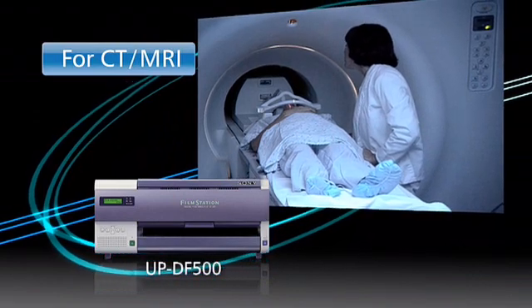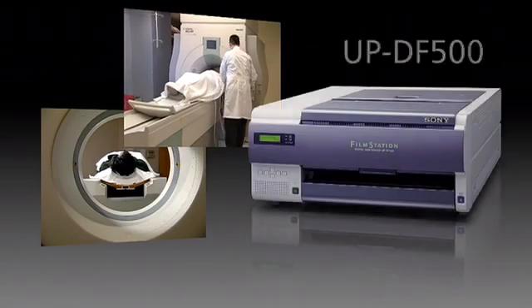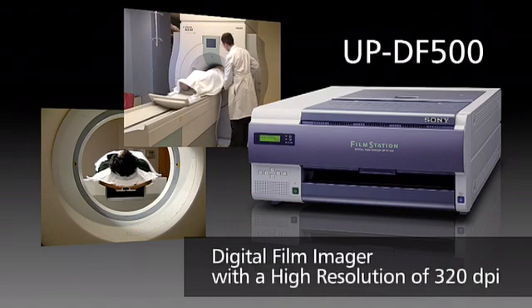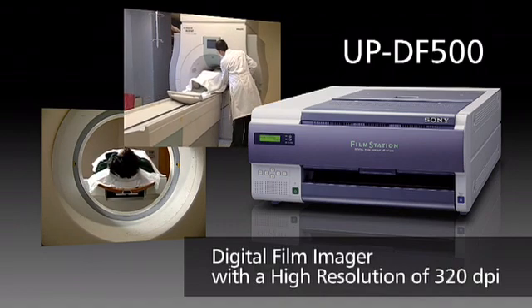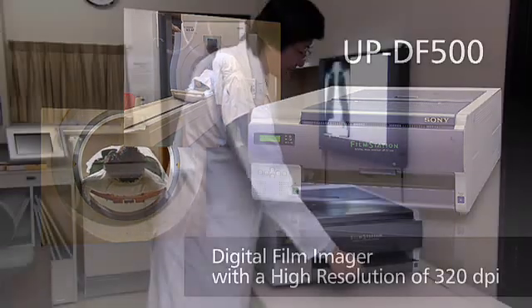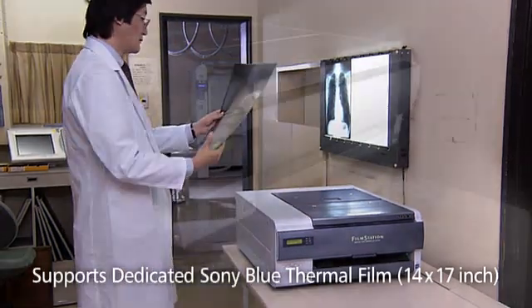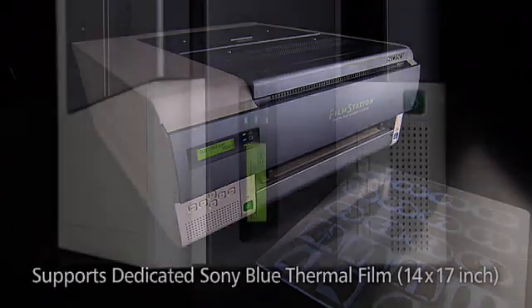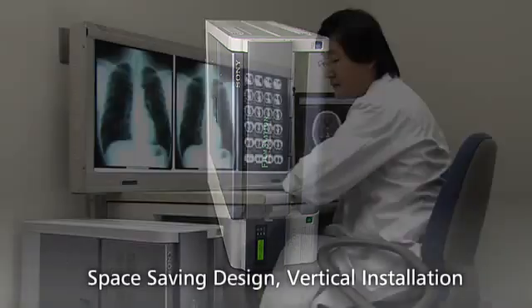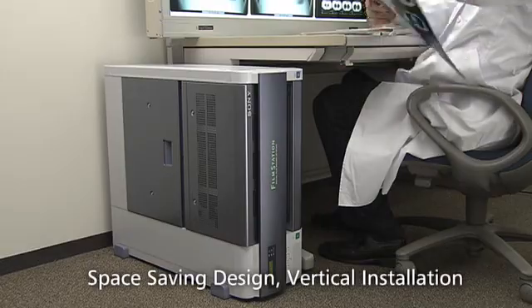For CT and MRI applications, Sony offers the UPDF500. This digital film imager has a high resolution of 320 dpi and produces high quality black and white 12-bit printing, which provides 4096 grayscales. It can print clear and high quality images on 14 by 17 inch blue thermal film for diagnosis. The UPDF500 comes in a compact size that can be mounted either vertically or horizontally, allowing it to be installed virtually anywhere.